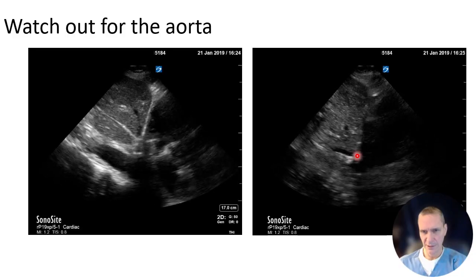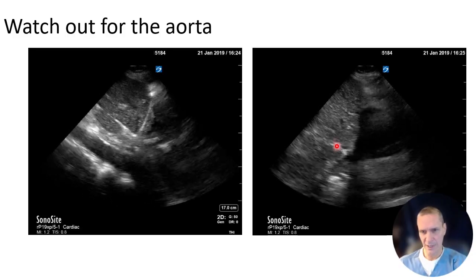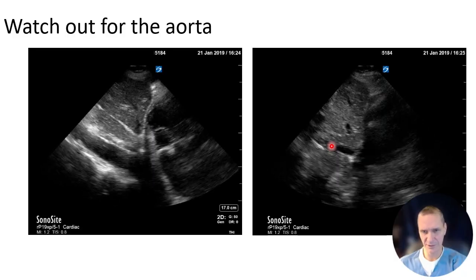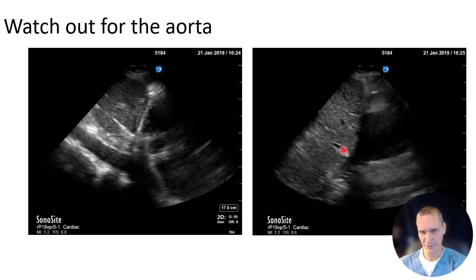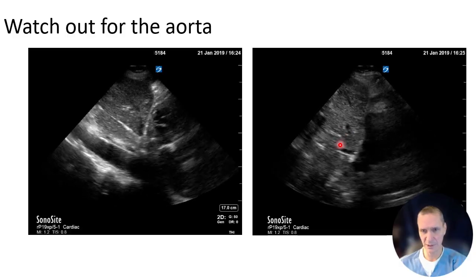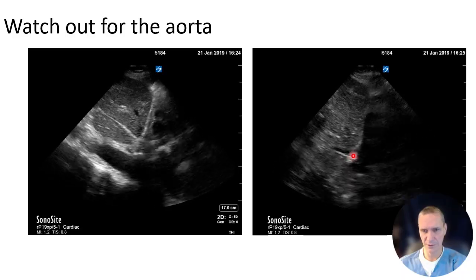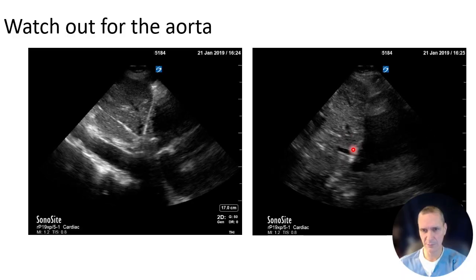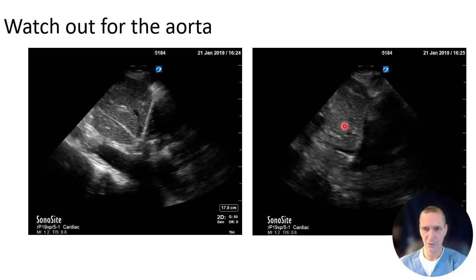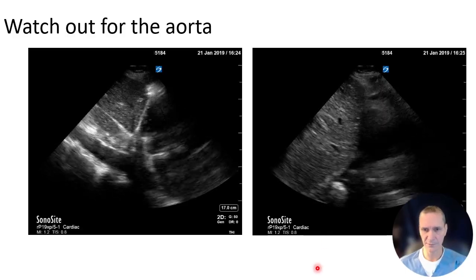And I have to be honest with you, I didn't capture this image. The size here, it's small. It looks like the IVC, but is there also some pulsatility? And I don't know, just looking here, I don't see the hepatic vein dumping in. So I wouldn't use this particular image to tell me anything, and I would try to find another image, either go transverse or find the hepatic vein dumping into the IVC.